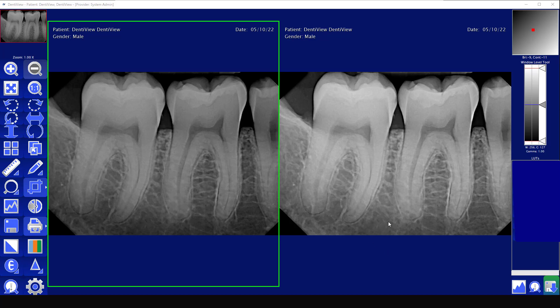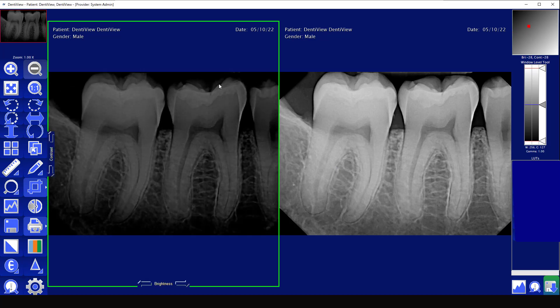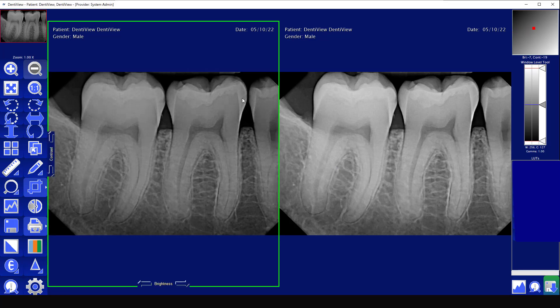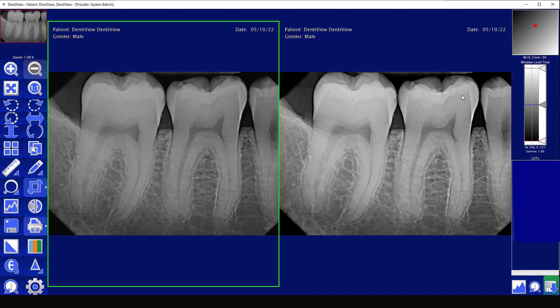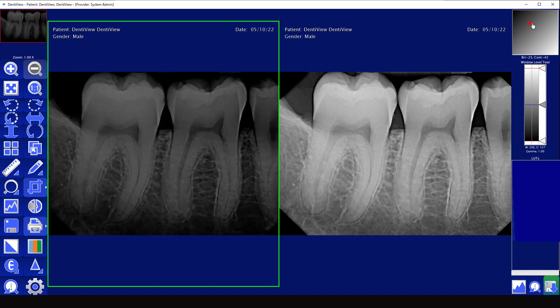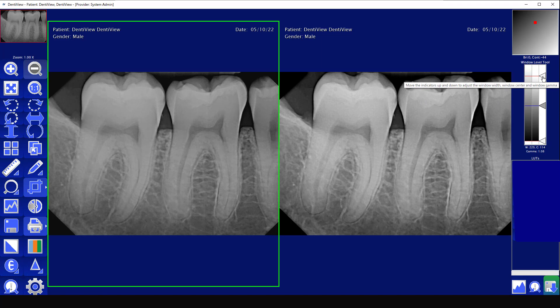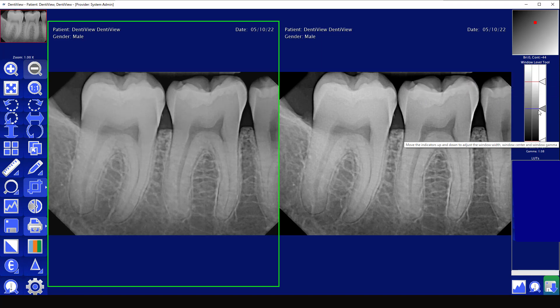You are able to change the brightness and contrast in a couple of different ways inside of the software. The first is by dragging across the image. You also have the ability to use the box in the upper right corner. A third option is dragging the triangles in these boxes in different directions up and down to make it look different.